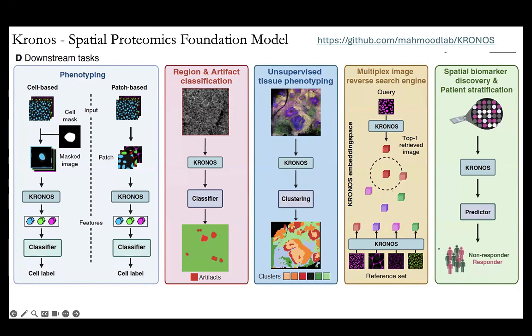the basis of how this data is analyzed today, more looking at how cells are effectively interacting and how protein is expressed, and finding those common features across. And then finally also looking at patient stratification and biomarkers. So we have some of these examples, and we're already in the process of substantially expanding this.